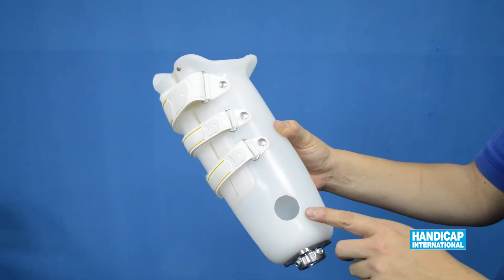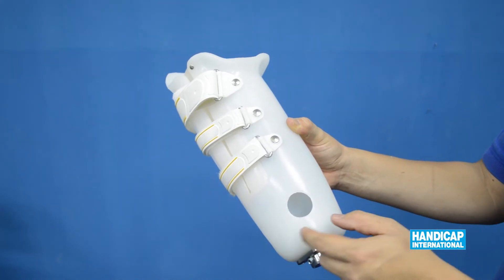Make an opening on the distal medial anterior side of the socket.